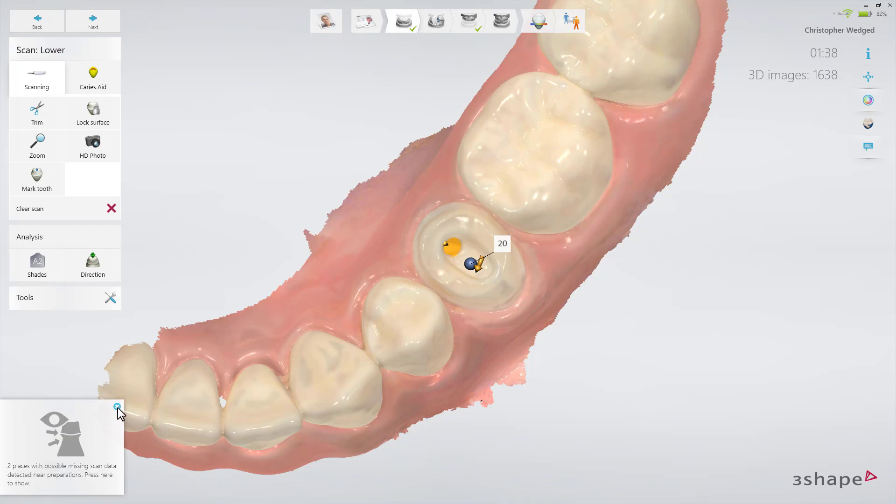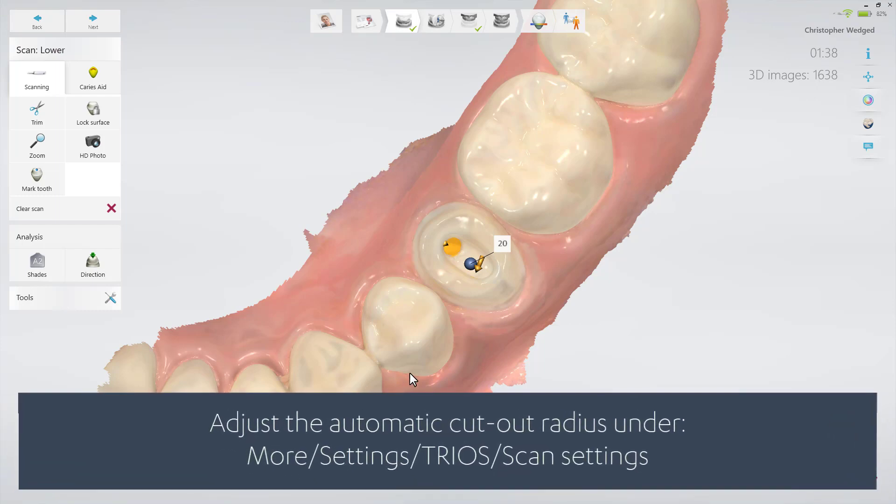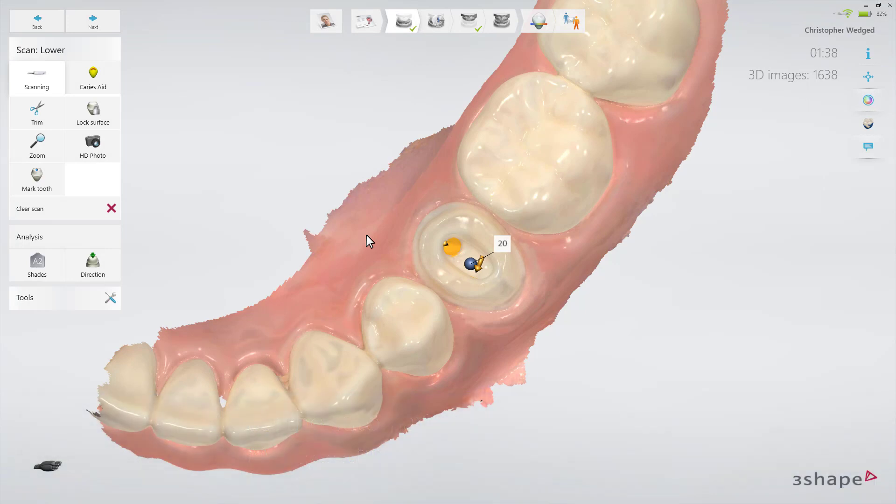You may adjust the automatic cutout radius under More, Settings, Trios, Scan Settings, or you may turn it off completely if you prefer to trim manually. Always use the smallest cutout area possible for a given restoration.